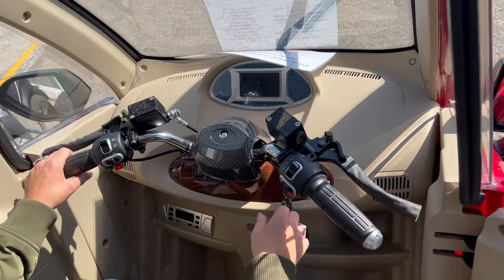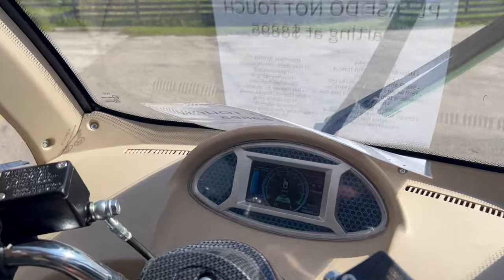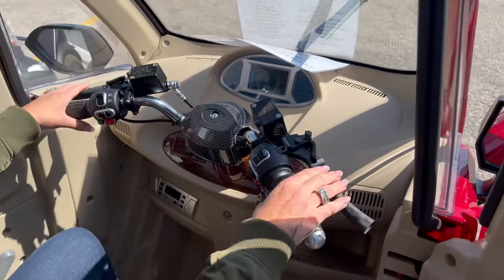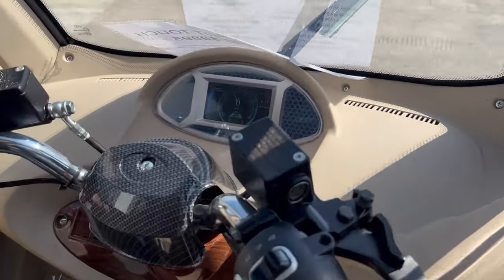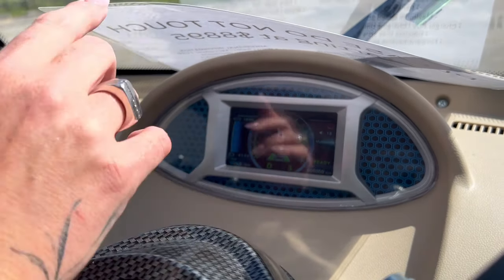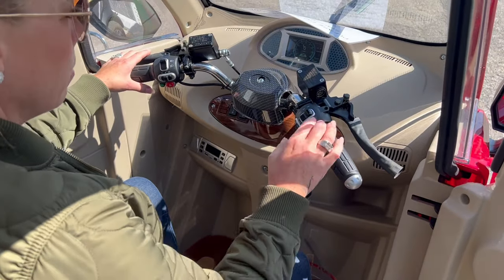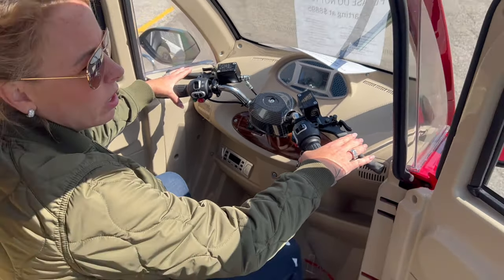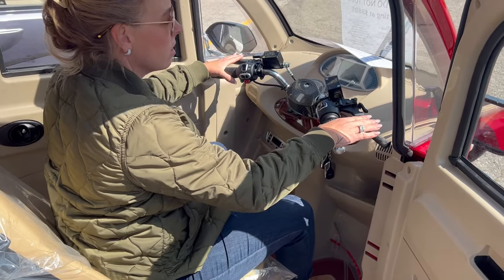When you turn it on, you get a full color LCD screen. I love this because it gives you the percentage of your battery, which is really easy to understand. It gives you your voltage as well, but it also gives you a percentage — and that's nice because not everybody understands voltage, but we all understand percentage. This does not have a motor brake, which means when you let off the throttle, you'll just continue to coast, and that's great because you can get more distance from it.